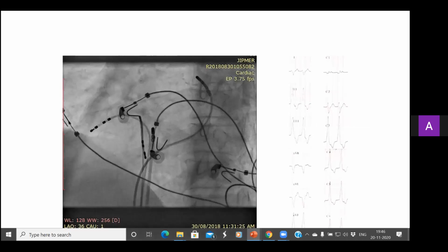Many a time in the EP lab, placement of the CS catheter during PVC or VT mapping is often overlooked, like the HRA catheter during an SVT study. We also observed that ECG findings may not be revealing sometimes to let us suspect summit VT. So in all cases of LVOT arrhythmias, it is imperative to position the decapolar catheter in the coronary sinus as deep as possible, with the distal bipole near the GCV-AIV confluence in the summit region, so that we can compare the activation time there with the other sites within the LVOT.